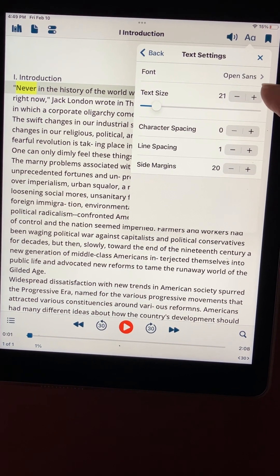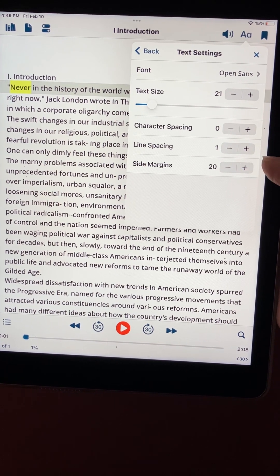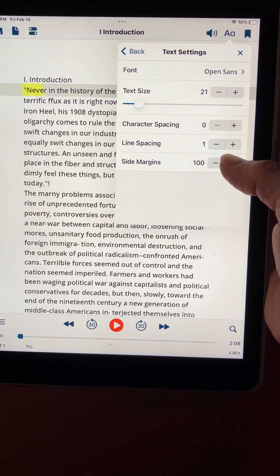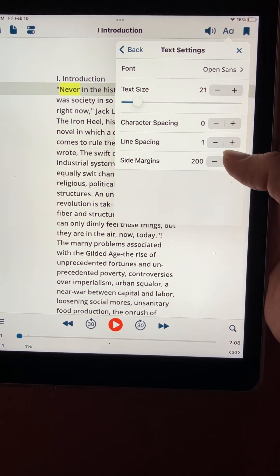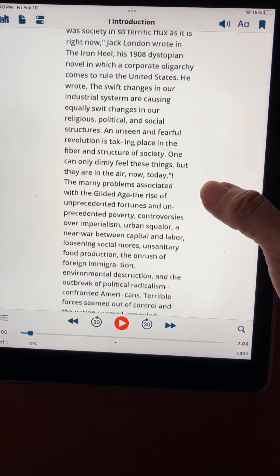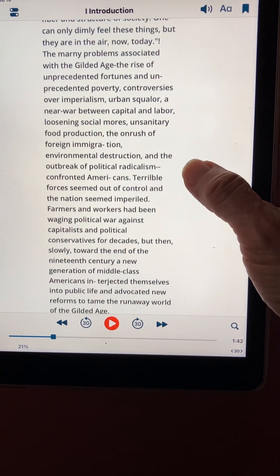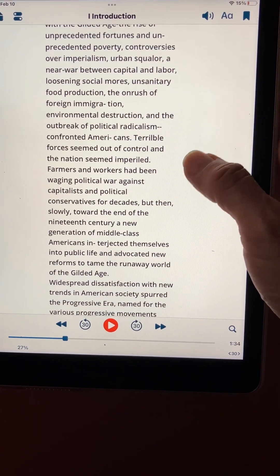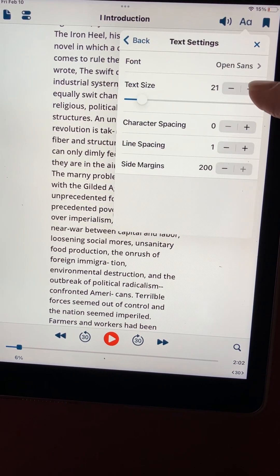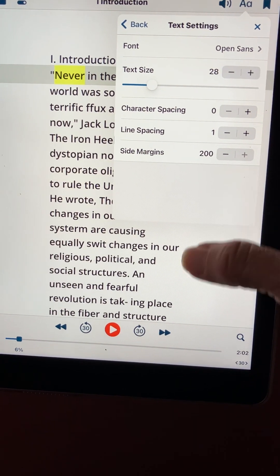We can change the font and the text size of course, character spacing, line spacing. We also can change the side margins, so if we bump up the side margins we get a narrow column. At this font size we're getting maybe four to six or seven words on each line. If we bump up the font size, then we might get fewer words per line.